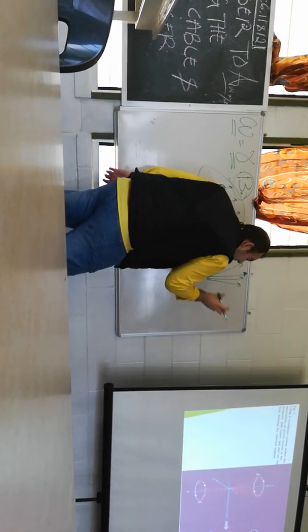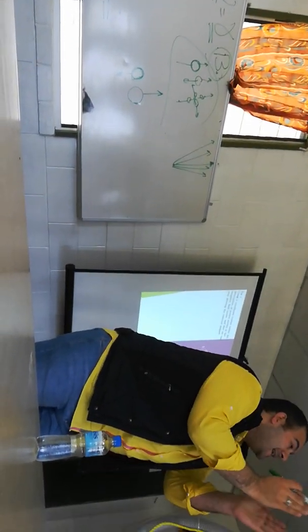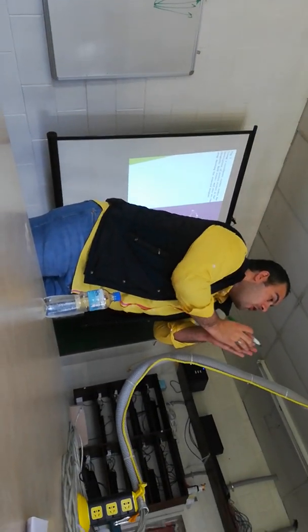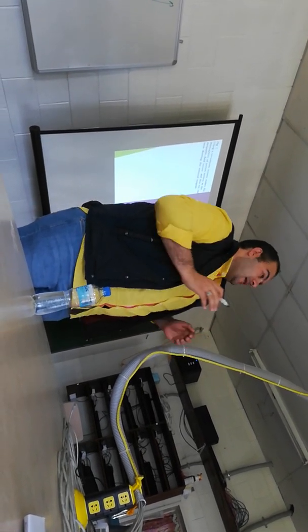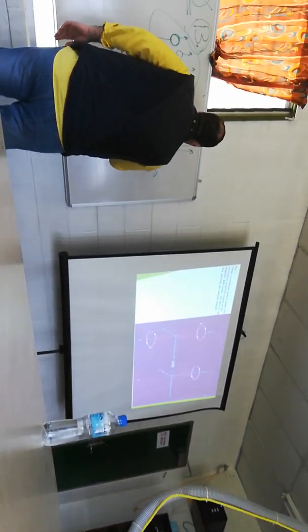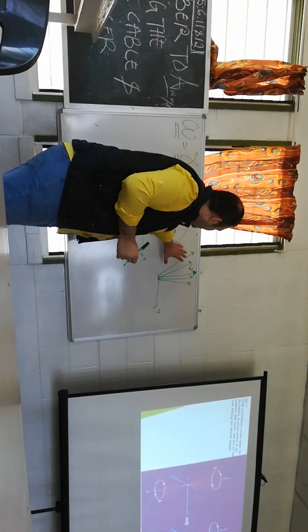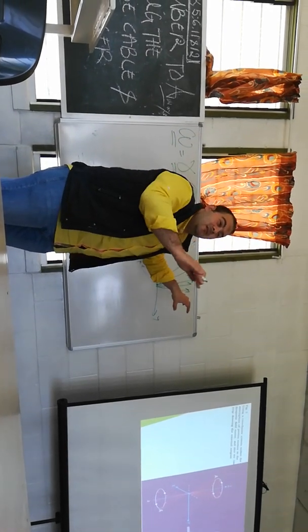All the magnetization coming from each proton will be summed to form the net magnetization, called longitudinal magnetization. Z, X, Y. So now I will give these protons radio waves.